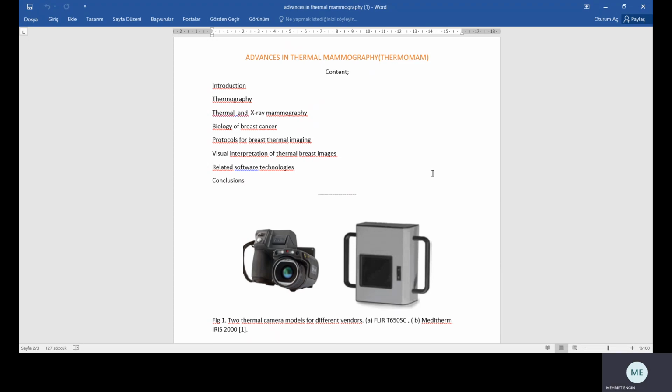Some software tools are available from companies intending to provide reproducible methods of interpreting thermal images. The technology is used in three such software tools, from RMI Health, Total Vision, and MammoVision, for example. All these approaches use static images obtained after cooling the subject with discrete imaging protocols.